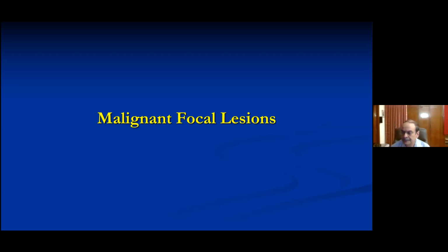So a follow-up question from Anand from Chennai again. He says, sometimes it becomes very difficult to differentiate a dysplastic nodule from typical regenerating nodules, and asks if there are any tips to try and differentiate between the two. That's absolutely correct. A dysplastic nodule can be very difficult and challenging to distinguish from an early HCC also.